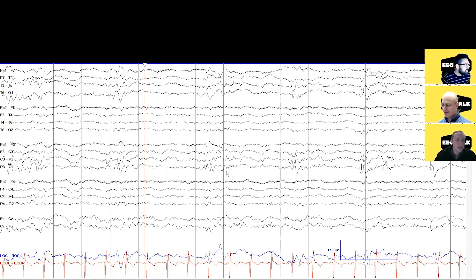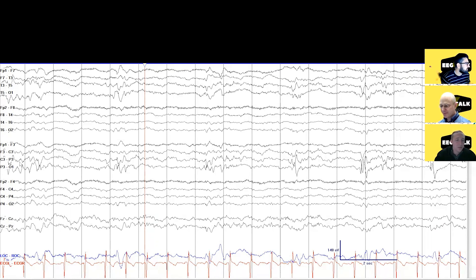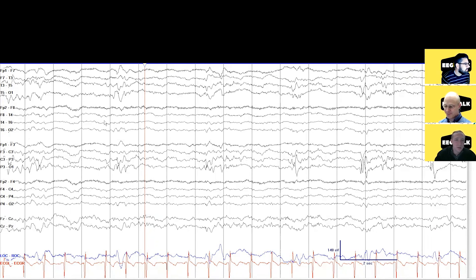Whenever I'm first looking at an EEG, I want to orient myself to the montage. This EEG is in bipolar — it has a left temporal derivation and right underneath it, so I can directly compare to the right temporal derivation. It has the left parasagittal, right parasagittal, and the midline. I want to assess the gestalt feel — is there symmetry between the two sides? From a preliminary level, it looks dramatically different.